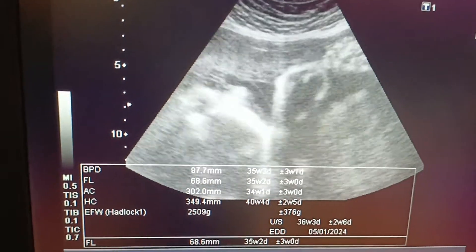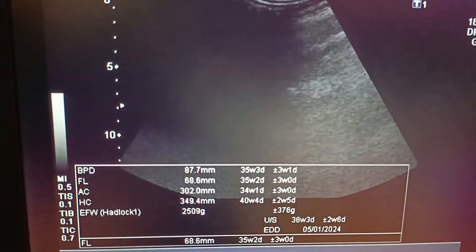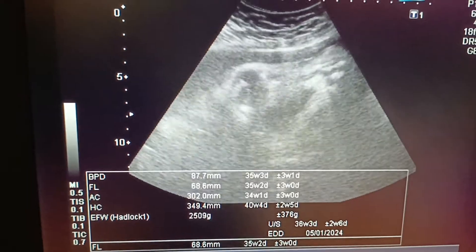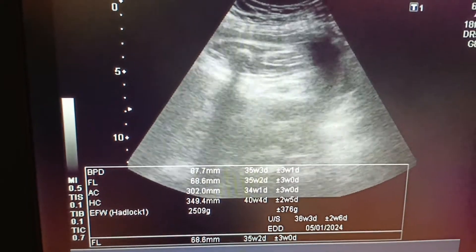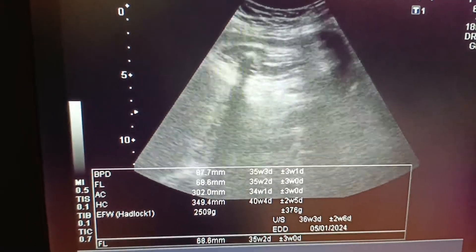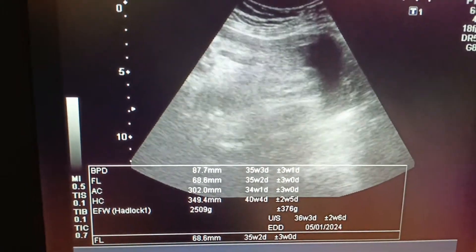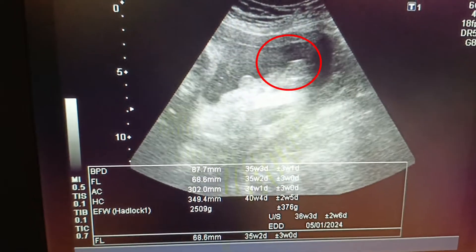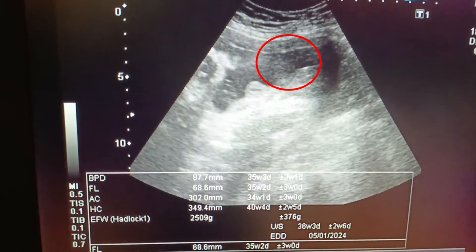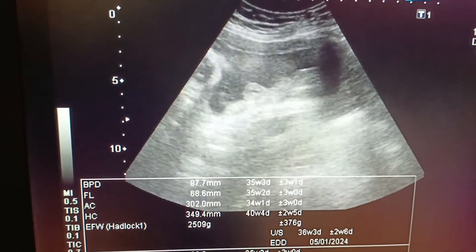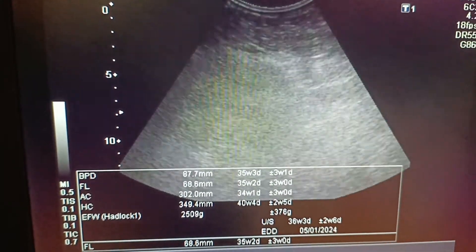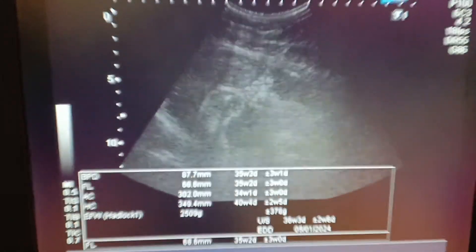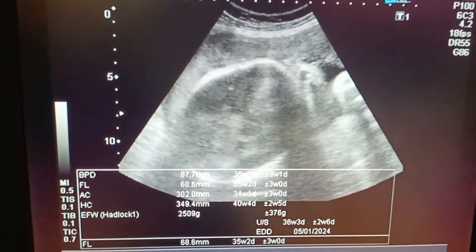Gender is usually identified between the two femoral bones. You can see the scrotal sac clearly. The liquor pocket is also present.